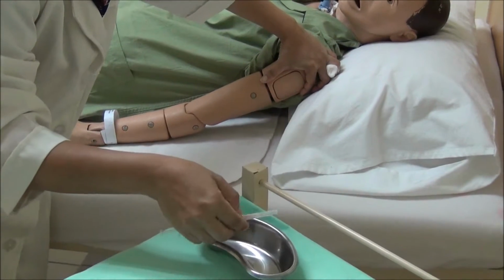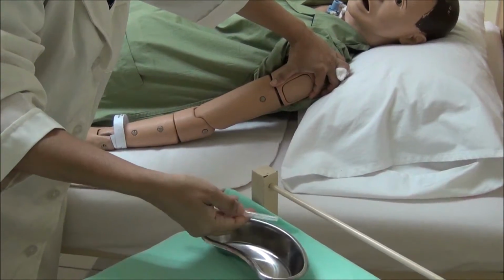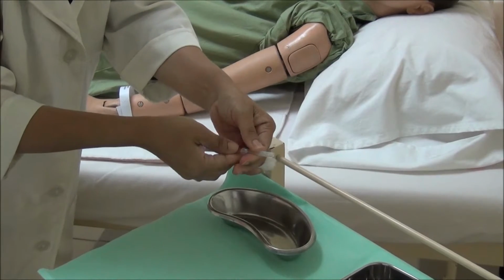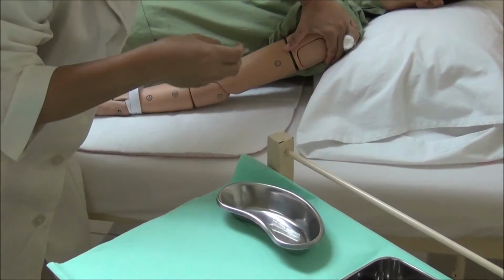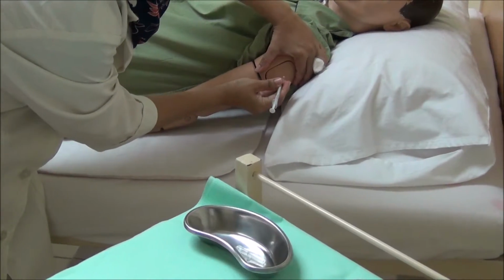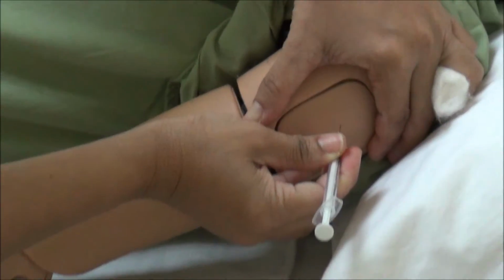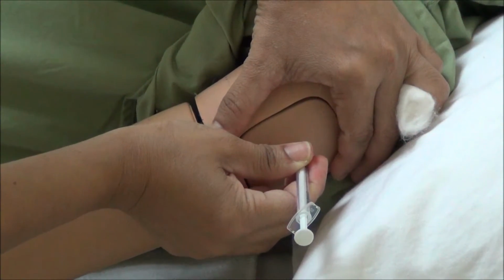Place and hold dry cotton between 3rd and 4th fingers of non-dominant hand. Hold syringe with dominant hand between the thumb and index finger. Remove needle cap with non-dominant hand. Grasp about 2.5 cm of skin or fatty tissue between thumb and finger of non-dominant hand. Tell the patient to breathe in and out. Okay, sir. Breathe in and out.